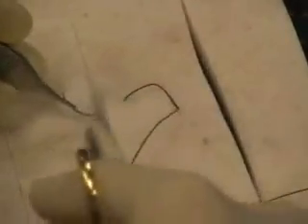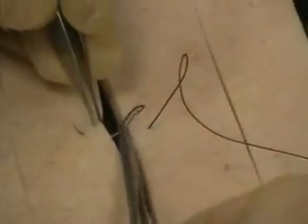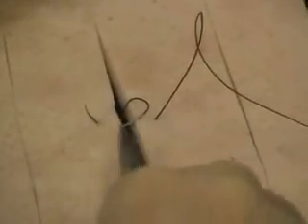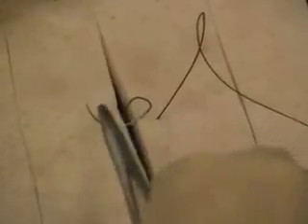If you can take this all in one bite all the way across, then go ahead and do so, but a lot of times you'll find that you'll bend your needle and force your needle. So a good thing to do is about right here, reload halfway through. Pull this through and reload, same place that we had talked about before, and try to enter at that same distance and come out approximately the same distance. From here to the wound is from here to the wound, should be about the same. And the place that we went across was at the same level, not too high or too low.